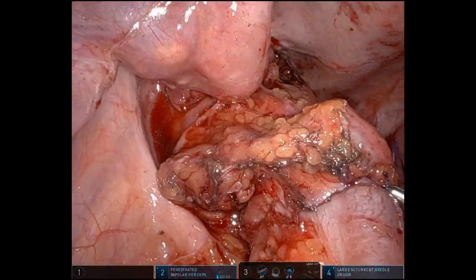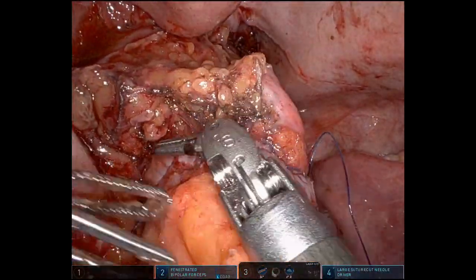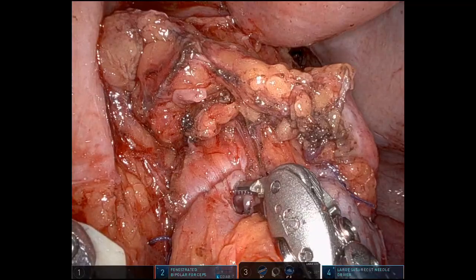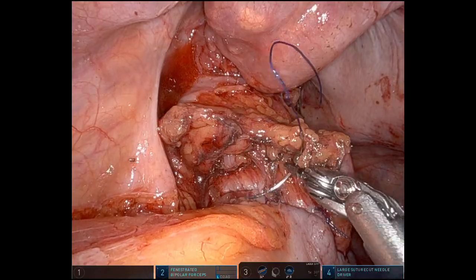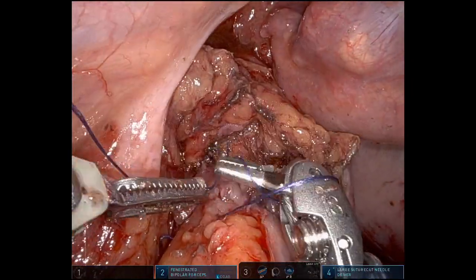It's very important to look at the lateral and the posterior wall. I have the assistant grab so we can get a better look and better exposure posteriorly. And when you look closely, it looks pretty good — but then you look right in the middle and there's a defect right there. It probably happened sometime during the dissection, and there's no reason to panic. We oversew pretty much all of the time, so when we see that, we basically just oversew it.